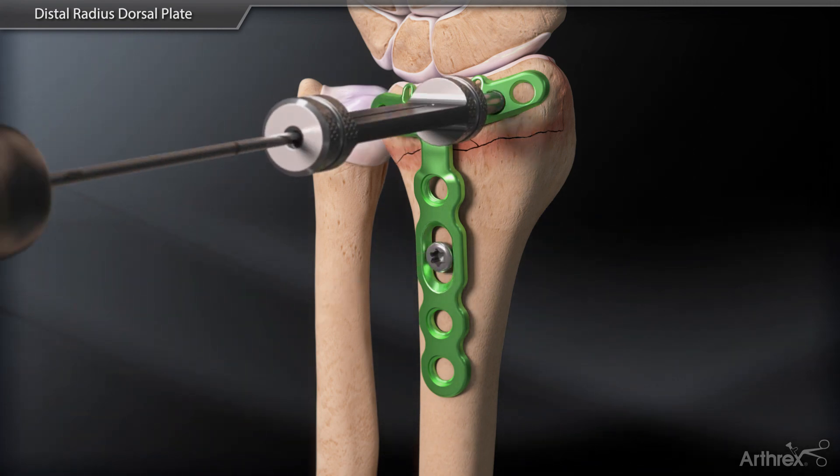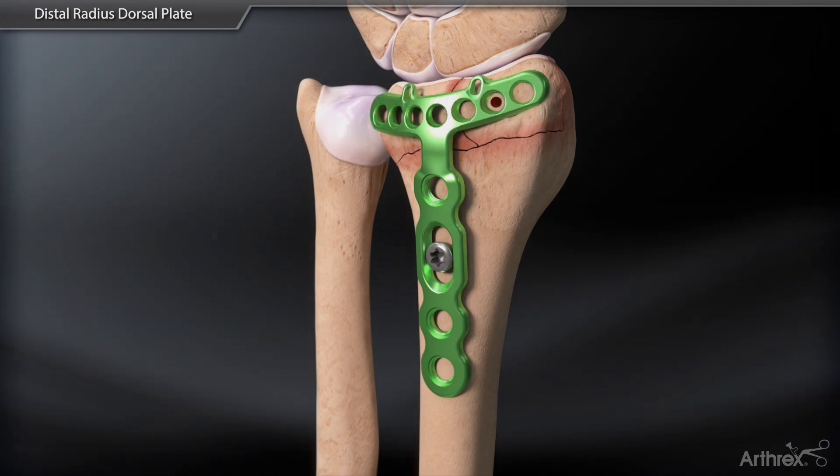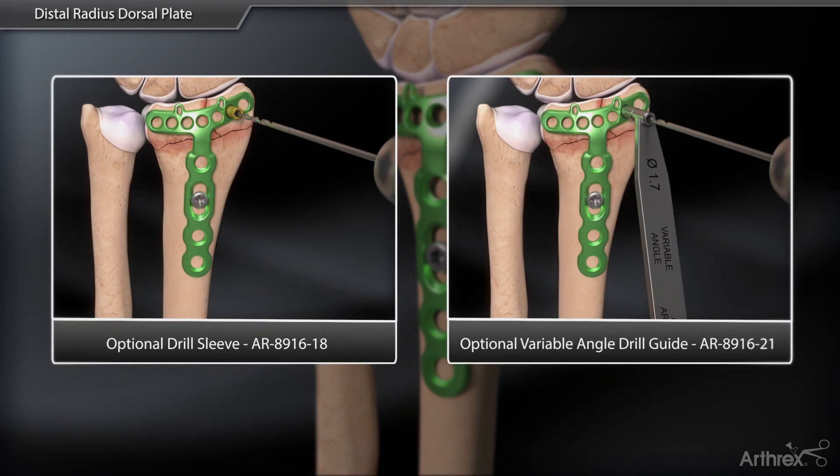Once placement is satisfactory, drill and place the distal 2.4 mm locking screws using either the locking drill guide, short drill sleeves, or variable angle locking drill guide.